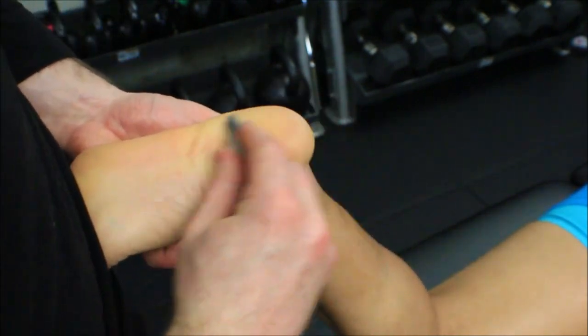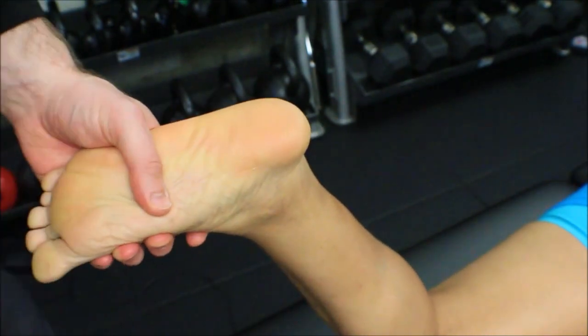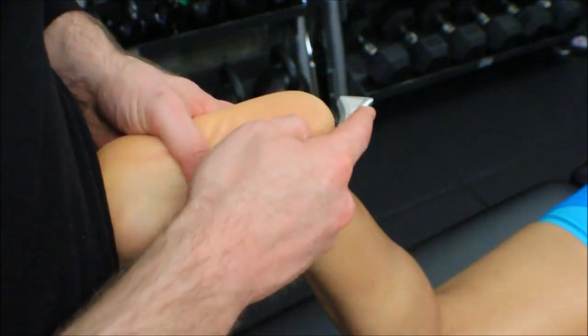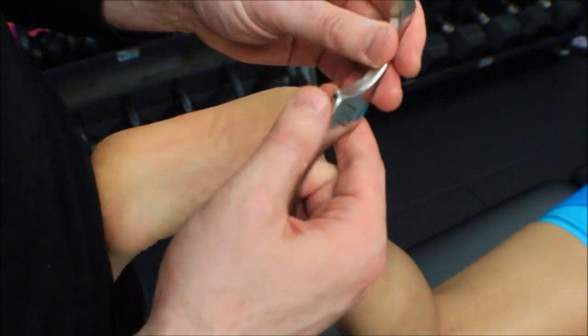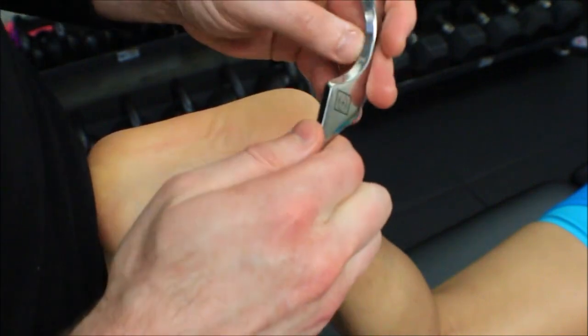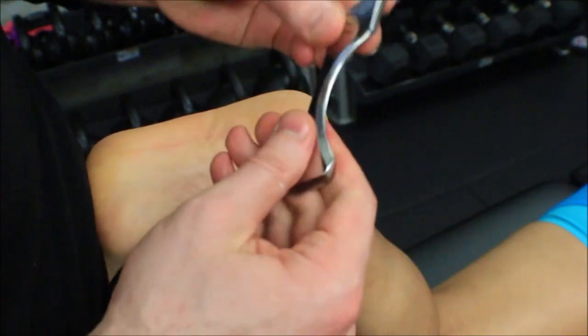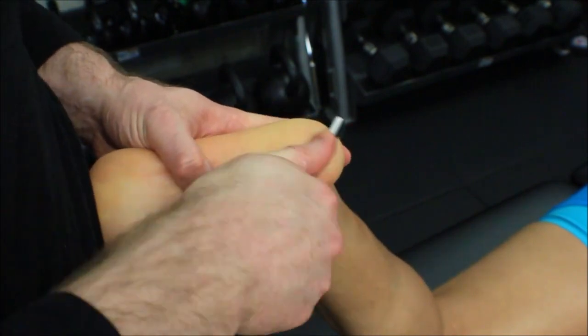Right, and then if I want to go over the heel, we're going to use this little hooked piece. I'm going to use the smaller surface, even though the smaller surface happens to be a single bevel. I'm just going to watch how hard I press, as opposed to the double bevel of the larger one of these. Right, kind of come through here, go in both directions.